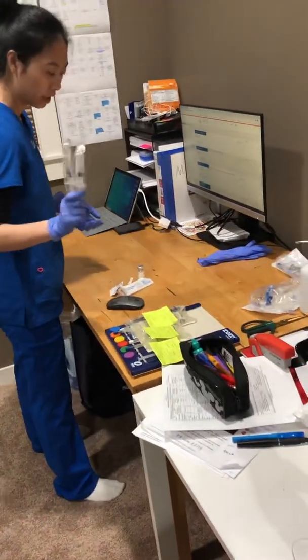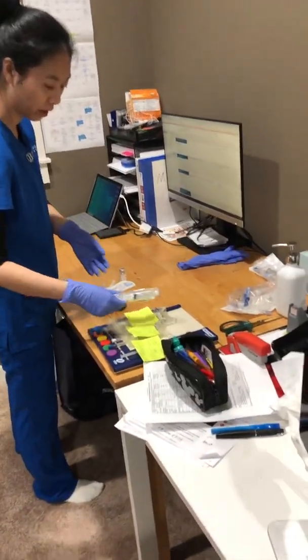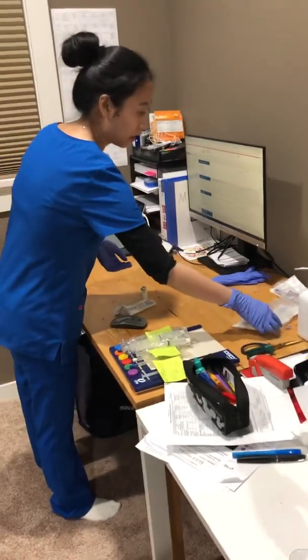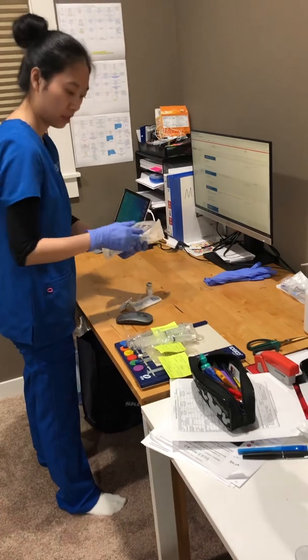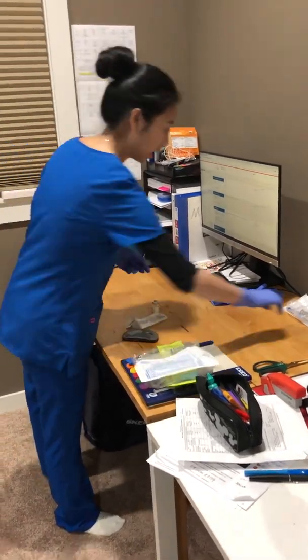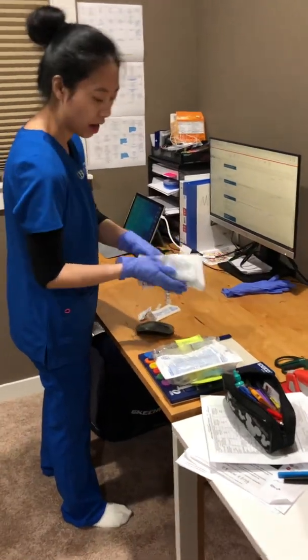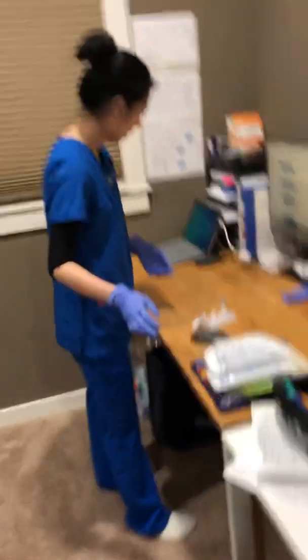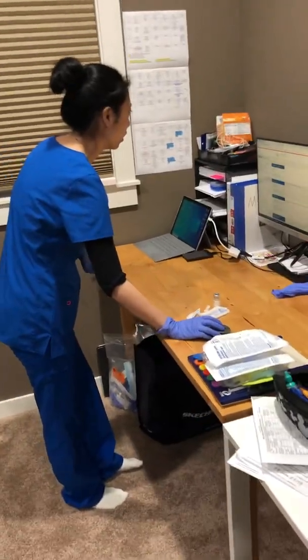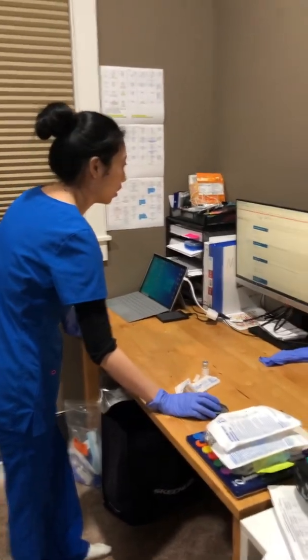And I also need some alcohol wipes, the normal saline flush, and the primary and secondary IV line. Okay, so now is this the right one? Then I close the order on Pyxis.